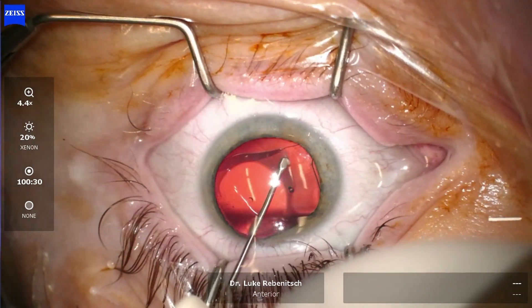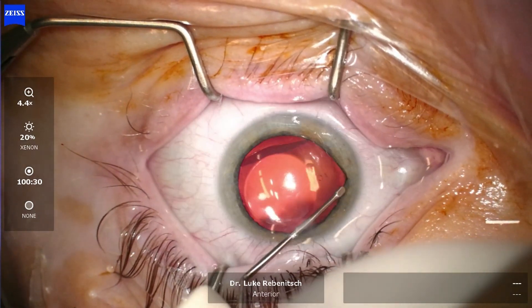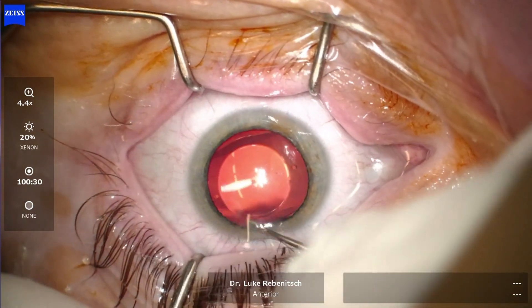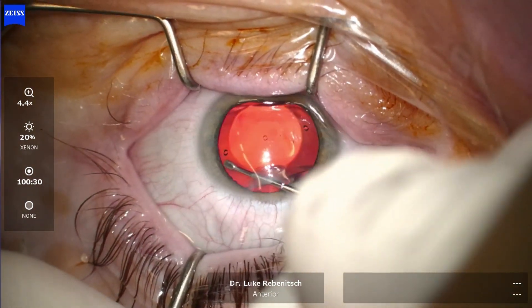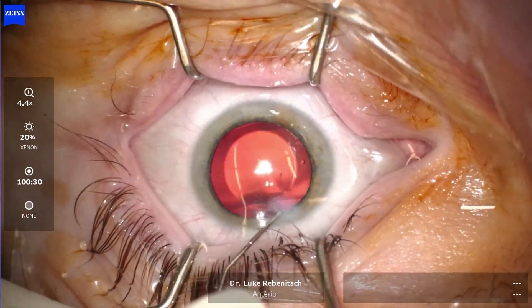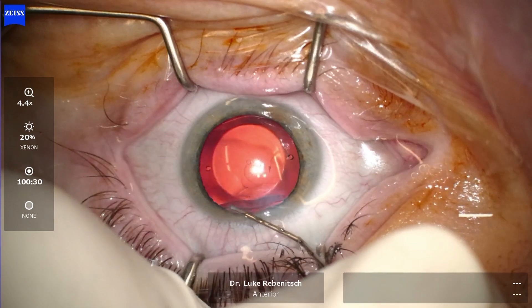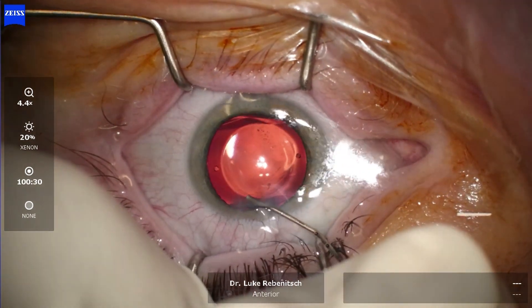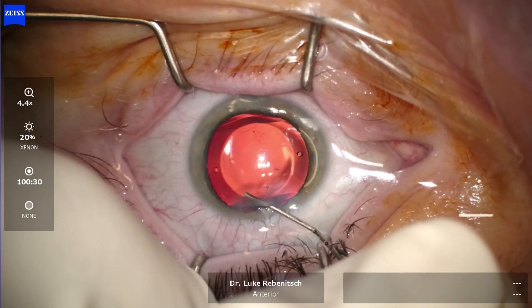With the previous generation of the ICL — the non-Evo — the lens had to be placed horizontally. You may be able to see a small hole in the center of that lens. That allows for fluid flow back and forth, which is one of the biggest benefits of the Evo ICL, as it allows the overall risk to be diminished by about 80%. The optic size is also larger, improving night vision as well.